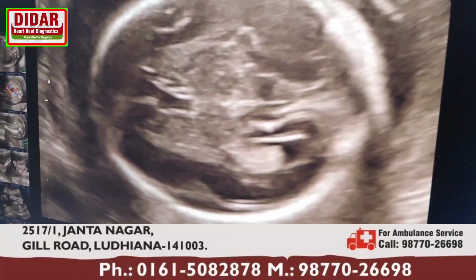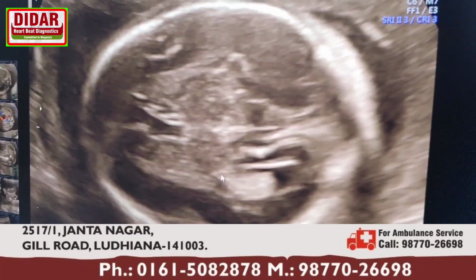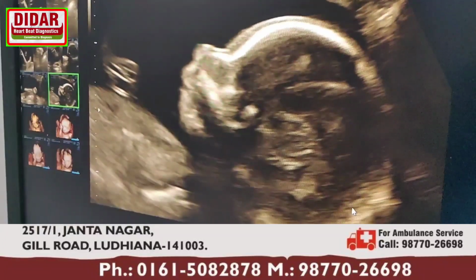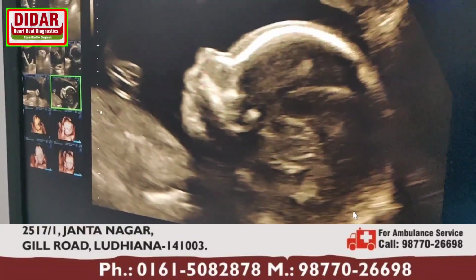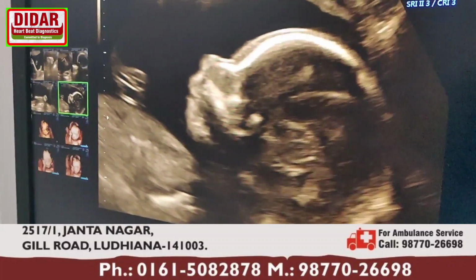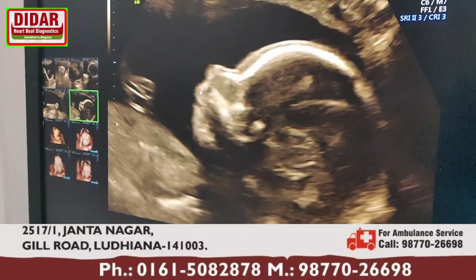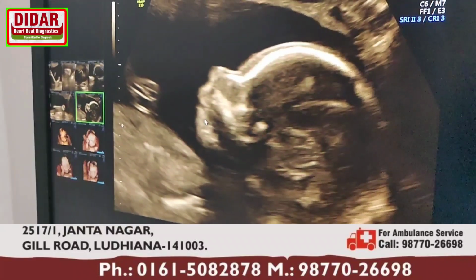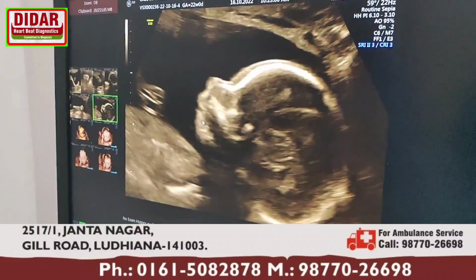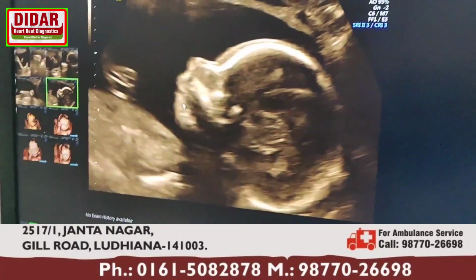This is the baby's head. In this, these are the skull bones and the inner side of the brain. A few patients must be wondering what a 3D 4D scan is. If we are able to get a good window, good liquor in front of the fetal face, this is the face profile view in a 2D image. Then we can do 3D reconstruction, or we can see the baby moving in 4D also.